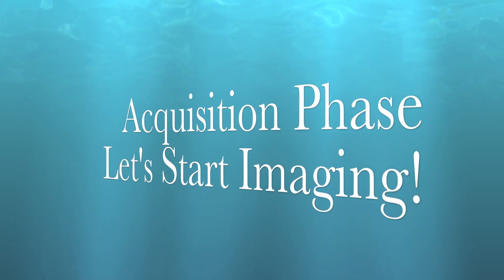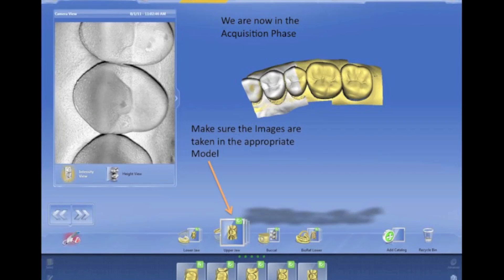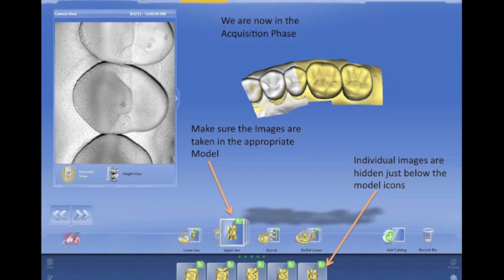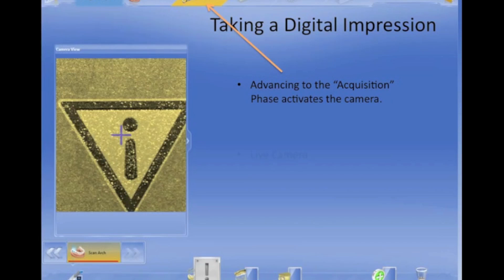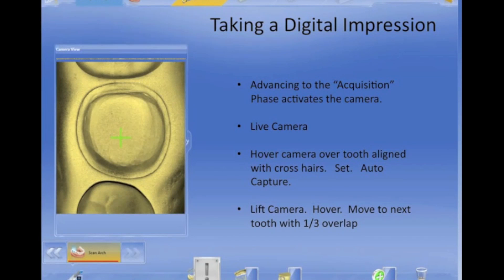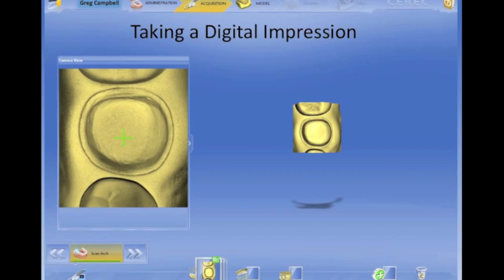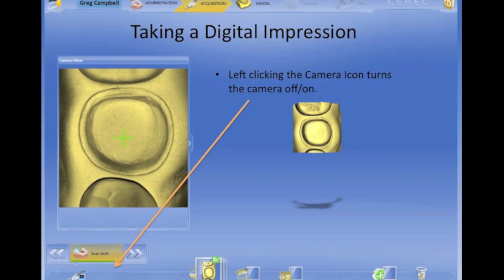Now we're in the acquisition phase — let's get imaging. In this phase, you're going to go down to the very bottom and make sure you take your images in the proper catalog. We now have upper arch, lower arch, and buccal bite instead of antagonist. Start with the most posterior image, put the crosshairs on there, and start capturing your images, working your way toward the anterior. On your last image, roll the camera about 15 to 20 degrees to the buccal, which will aid in your buccal bite imaging. You can turn the camera off and on using the camera icon on the lower left.